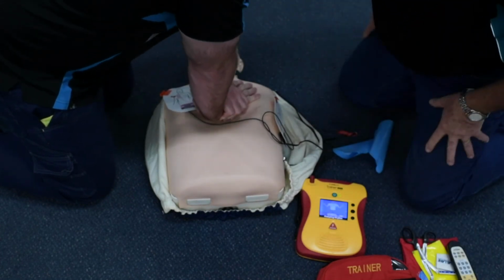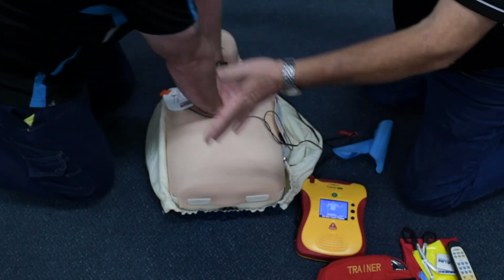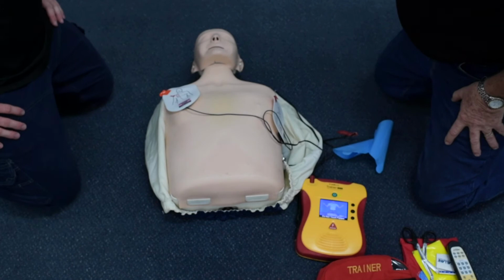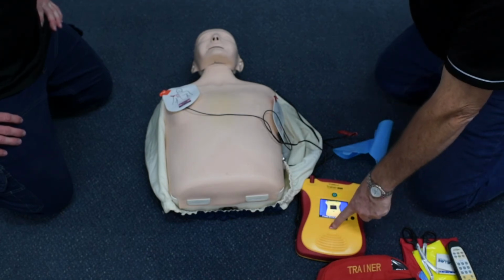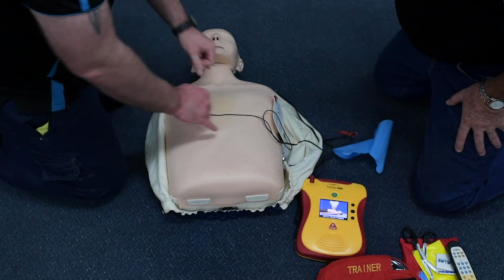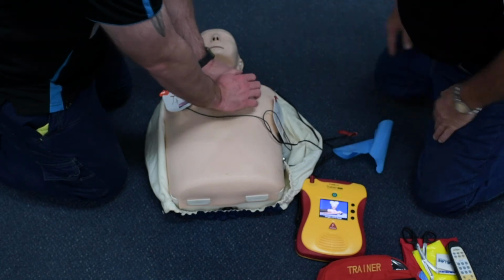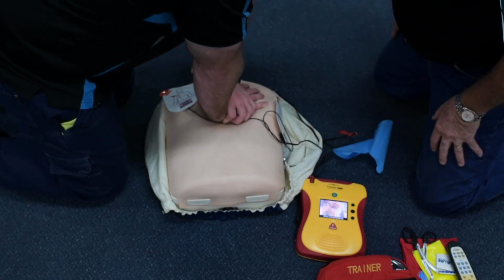Analyzing heart rhythm. Do not touch the patient. Move back, please. Stand clear. Shock advised. Charging. Press flashing shock button. Shock 1 delivered. It is safe to touch the patient. Begin CPR now. Give compressions.